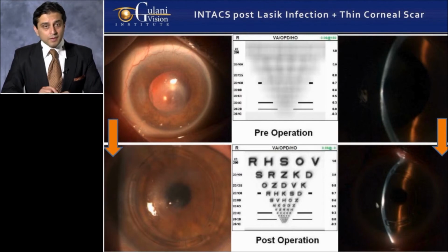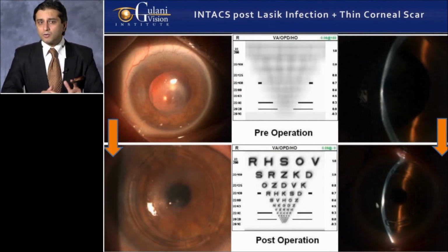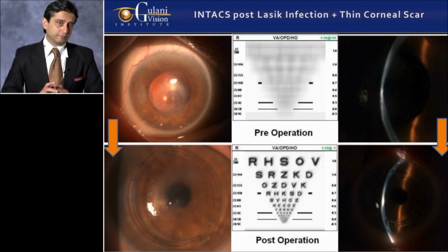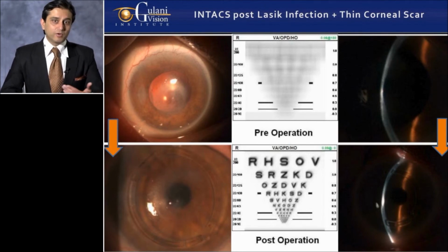So this thought process of designing surgery for cases, no matter how complex, unique, or difficult, and taking them to a self-designed surgery to the best emmetropic, what I call best vision potential outcome, I think is the need of the hour. The OPD-3 gives me a lot of the information that I need to discuss with the patient in the room, why I came to this plan, and then decide with them so they become a team with you. A team where you're going step by step towards better vision based on logic and safety.